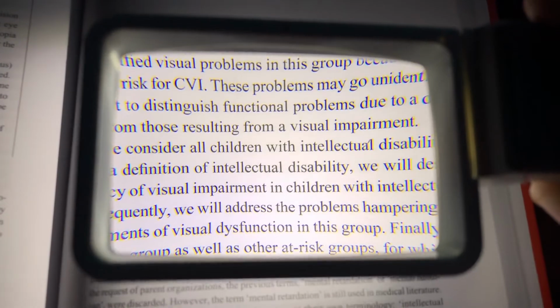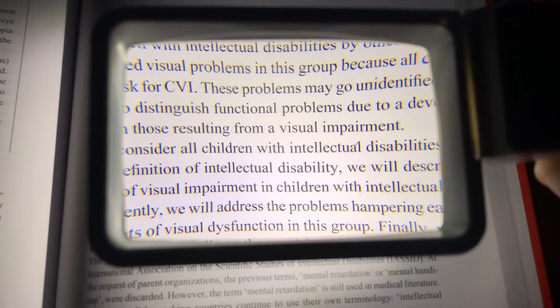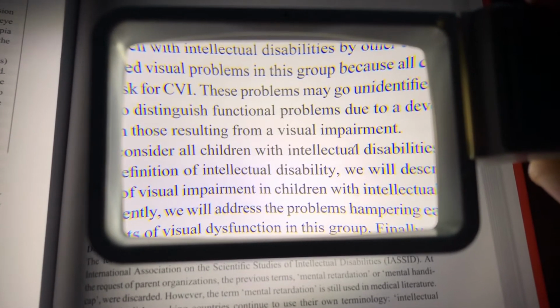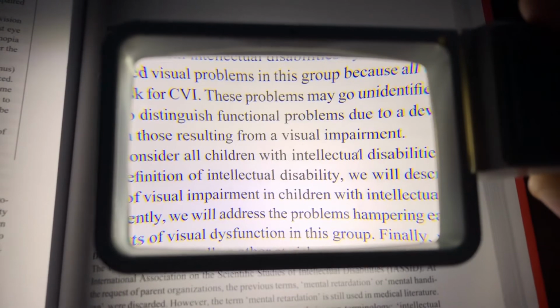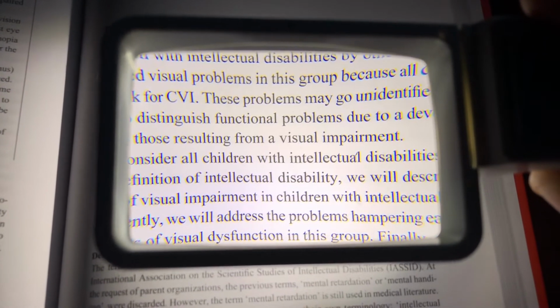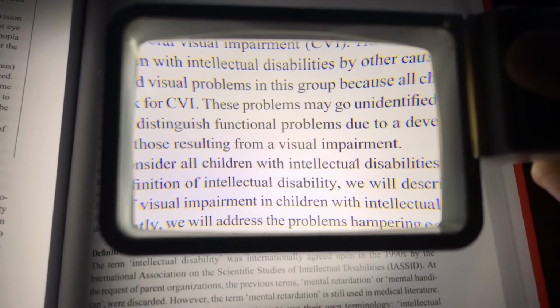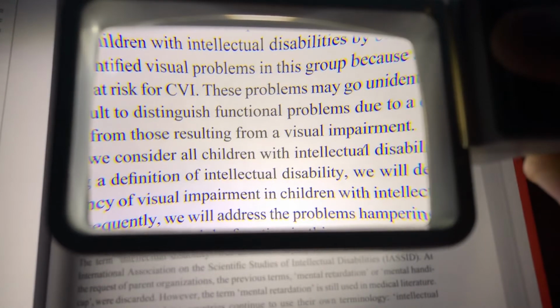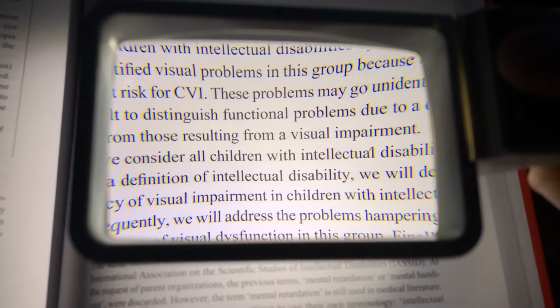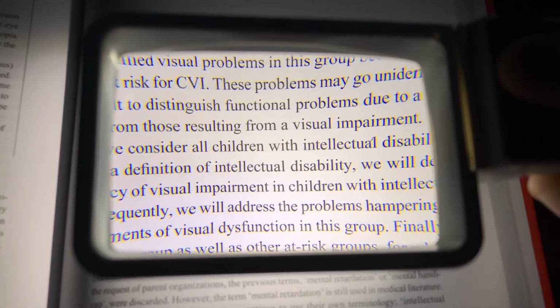So, slightly larger viewing area, equal degree of magnification, and equal, evenly spread light. The light that's on the Magno is slightly less intense than the light that is on the Optelec. It's a little bit less white of a light, but that could be an advantage to some clients, and to other clients they might want a brighter light.